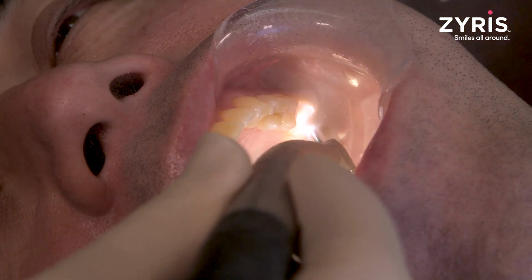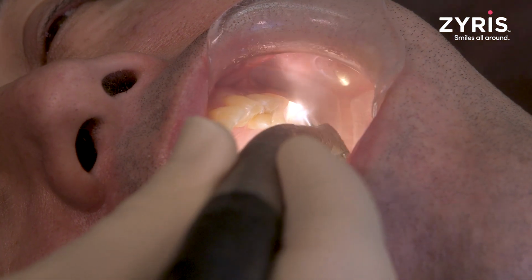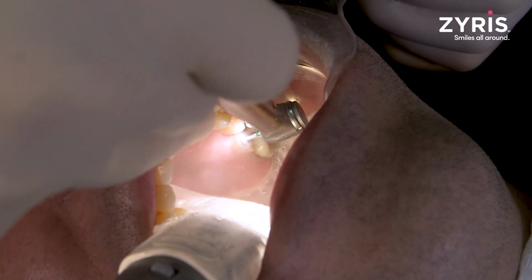Today we are going to be working on a couple of crowns on 14 and 15. Number 14 has some decay on the margin, and there was definitely an open contact between 14 and 15. Number 15 has a failing root canal. It looks like there was a missed mesial buccal canal too.